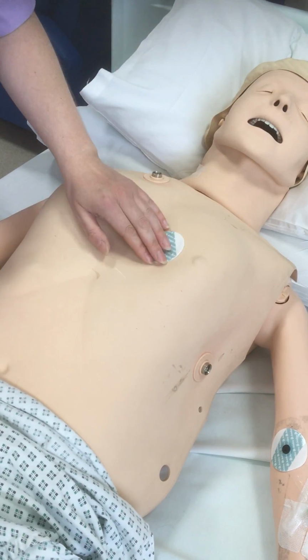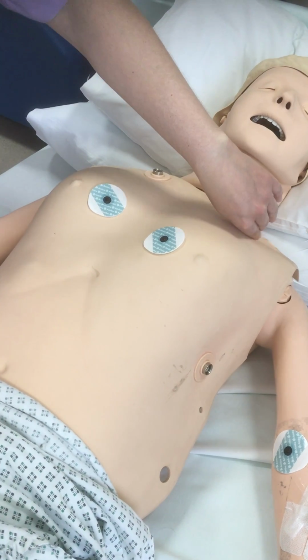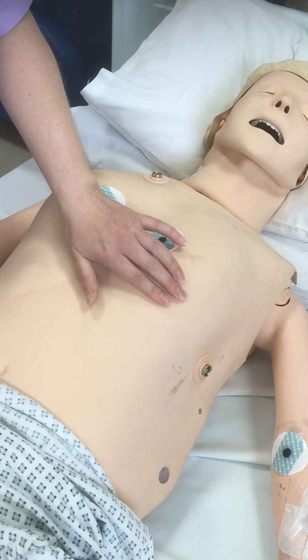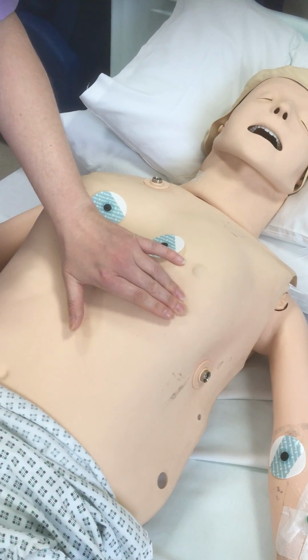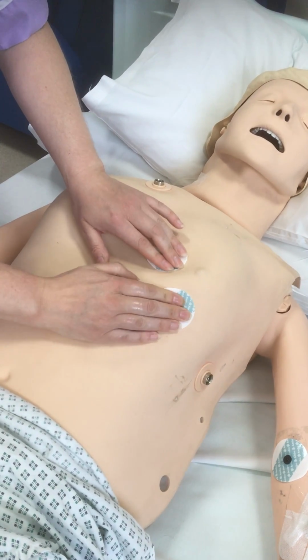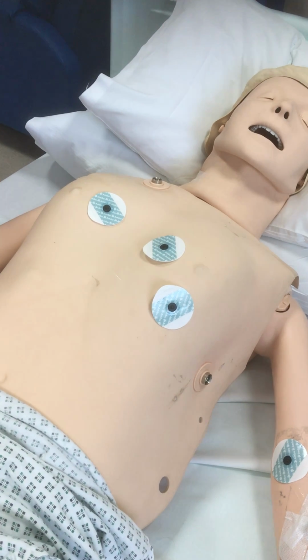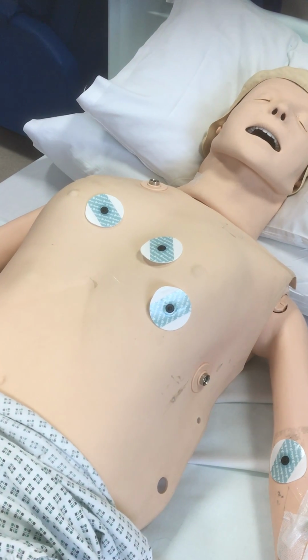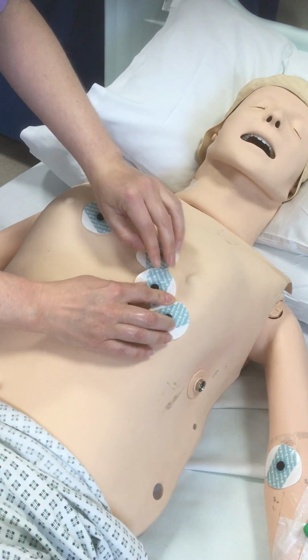V4 is in the mid-clavicular line, so centre of the clavicle down to the fifth intercostal space, which is just there. And it's usually in line with the nipple with male anatomy. Right. V3 then goes in the centre between V2 and V4.